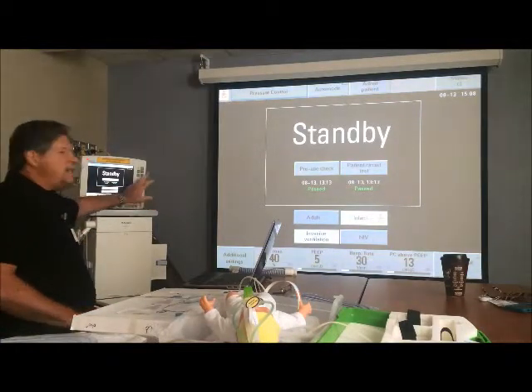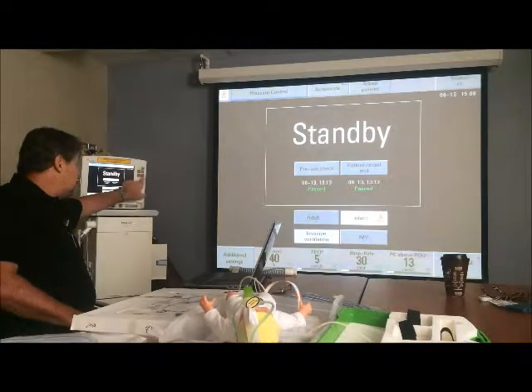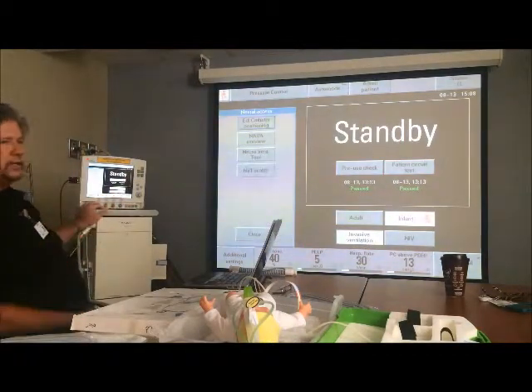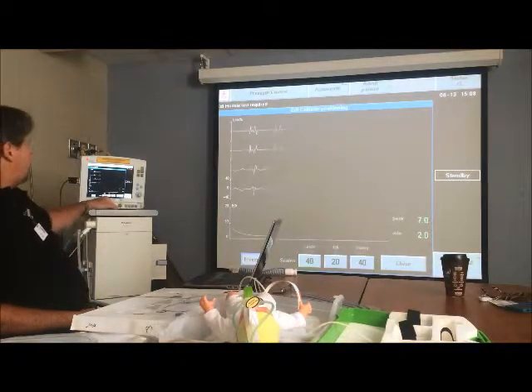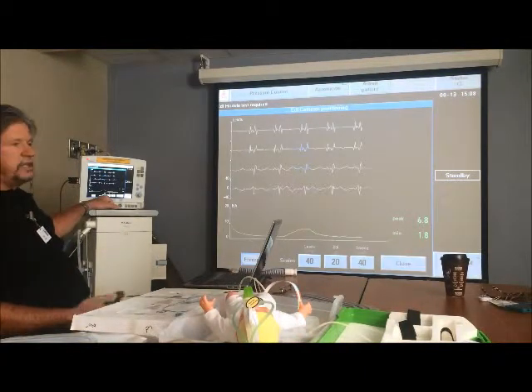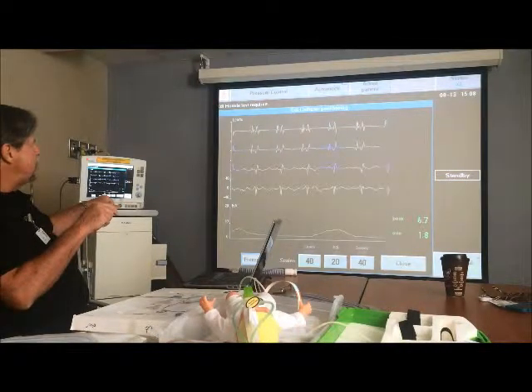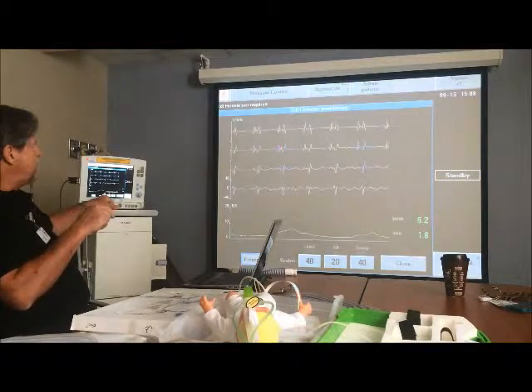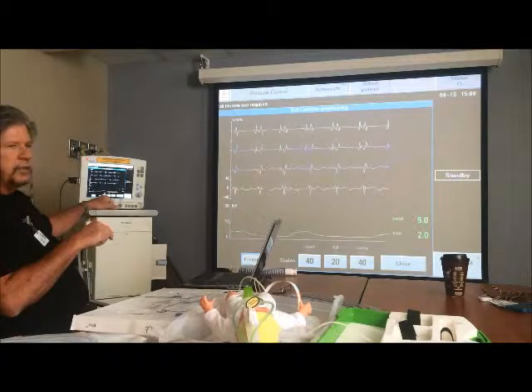So in order to see that positioning window, you have to go to the neural access button, which you'll see on your ventilators. This is my teaching screen. It doesn't have it on there, but you press this button, and then you have all these buttons that come up. So you press EDI catheter positioning, and there's our positioning window. So there's the slide that you saw just a minute ago with the QRS. That's actually the P wave, and that's the QRS. So the P wave and the QRS are big. They get smaller and smaller from top to bottom, and the P wave disappears at the bottom.